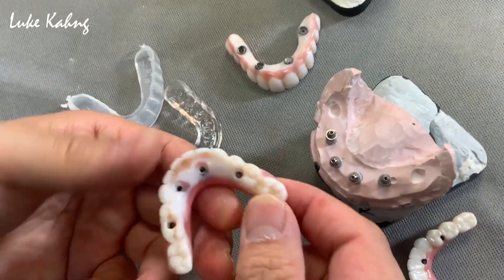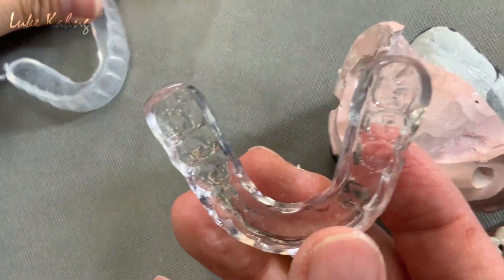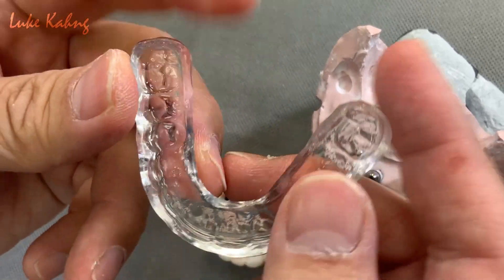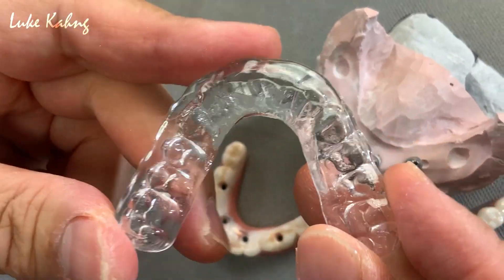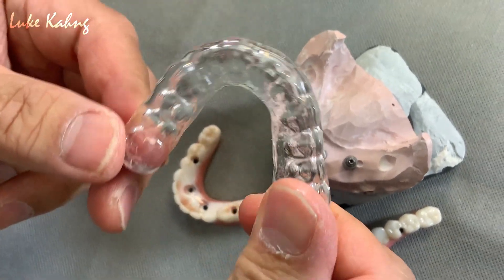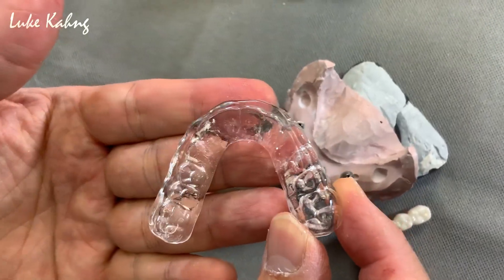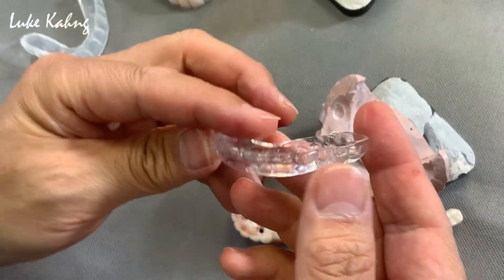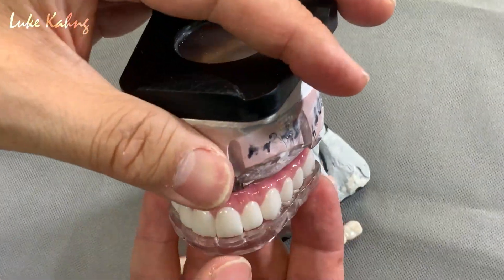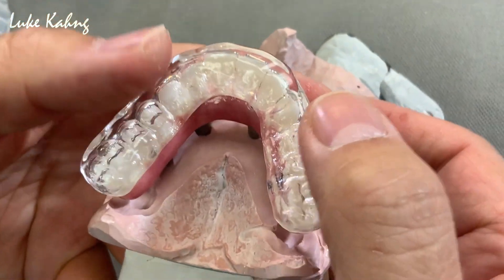Depending on the cases — we can see this is really really ground down. So we made a special night guard. I've made many videos on YouTube on how to make a night guard, both soft and hard. This one is not machine-made — it's handcraft-made. It's crystal clear and very durable.